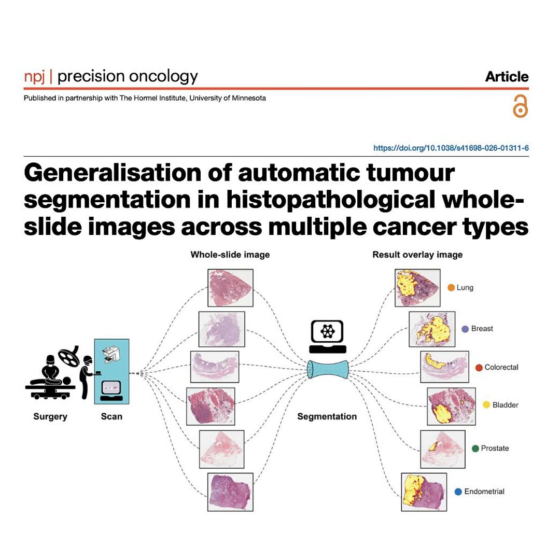Which naturally leads us to evaluate the human element. Yes, let's go there. Knowing the AI has these blind spots with tiny fragments, how does its overall robustness actually compare to human doctors and the messy reality of real-world hospital equipment? Because hardware robustness is a massive deal in digital pathology. Every hospital uses different brands of digital scanners. Oh, yeah. Totally different ecosystems.